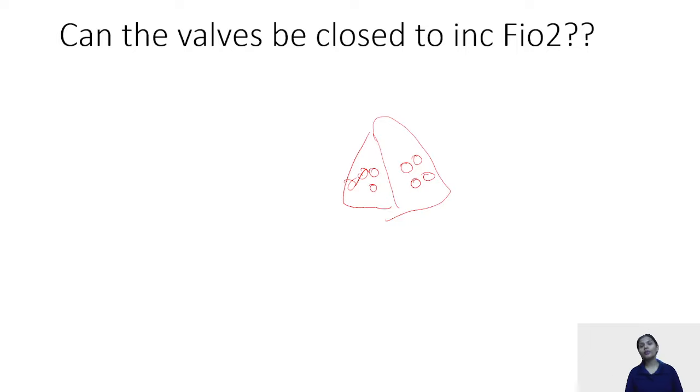And if these ports are meant for exhalation, then even the atmospheric air can enter through these ports. So someone thought, then let's cover these holes. Now, will that help?